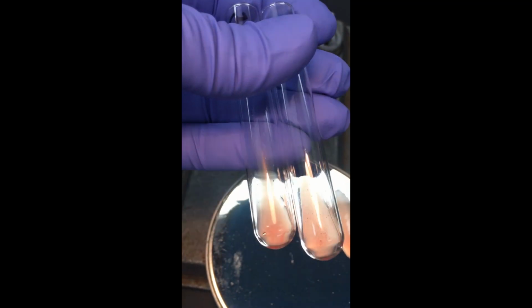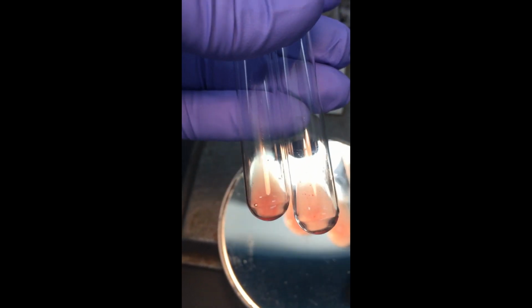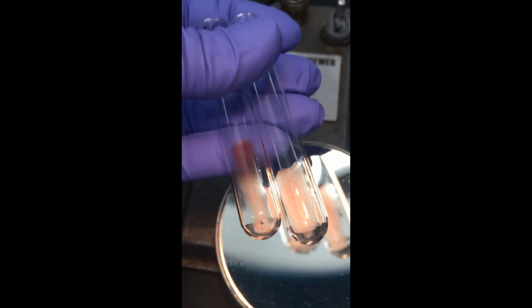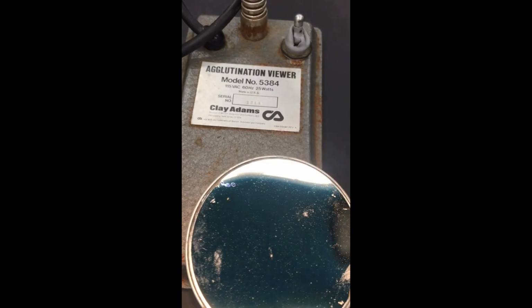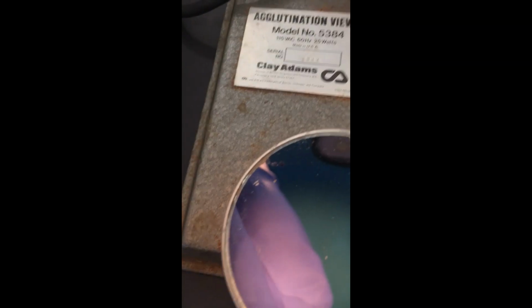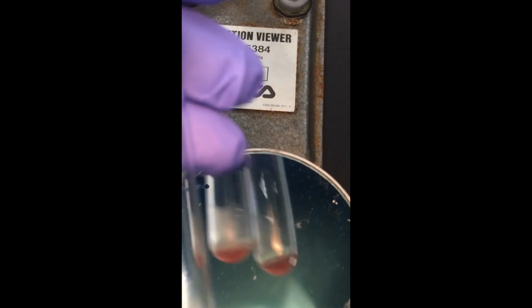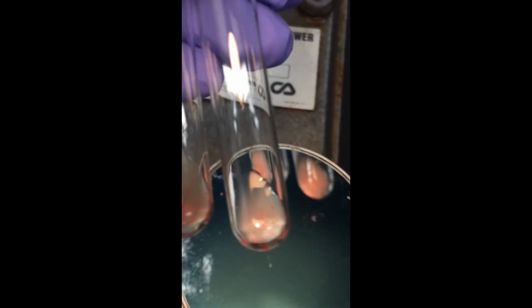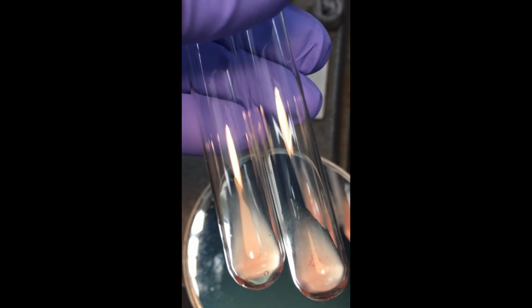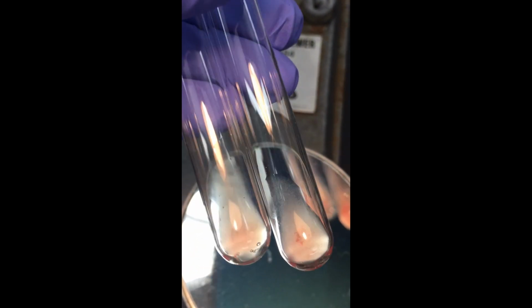Three is on the left, 4 is on the right. And tubes 5 and 6. Tube 5 is on the left, and tube 6 is on the right.